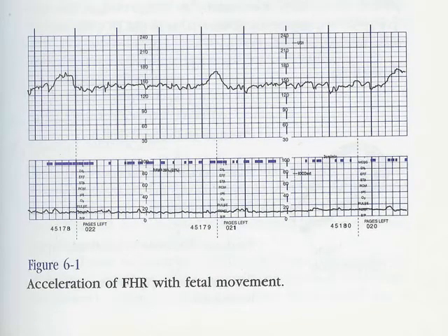Now let's put that into practice, what you've just learned about an acceleration. Looking at this strip at the top, because remember the 240 is going to be your heart rate side. This is just 100. Babies go higher than 100. So looking at the fetal heart rate side, what would you declare the fetal heart rate baseline to be?